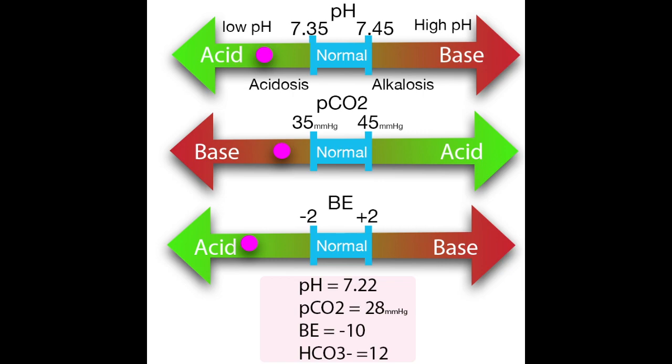Clearly in this case, the metabolic system is winning, if you like, or is said to be dominant, and the acidosis is metabolic in nature, with the respiratory system trying to compensate. And that's blood gases pretty much in a nutshell, or at least that's blood gas acid-base balance.